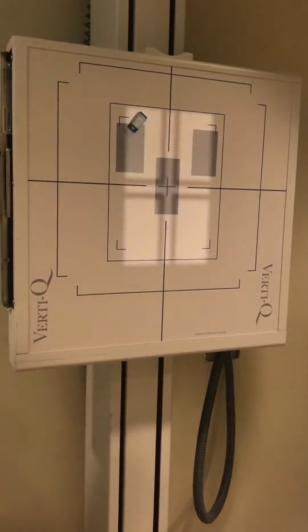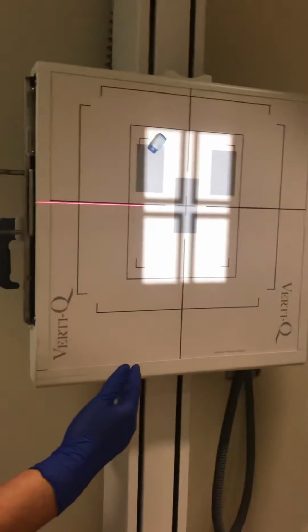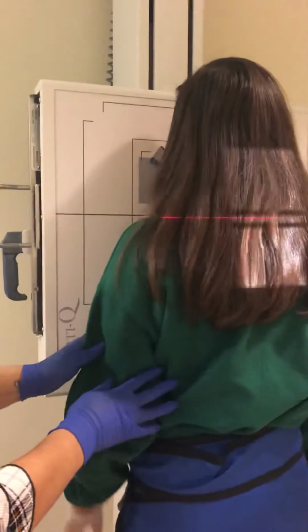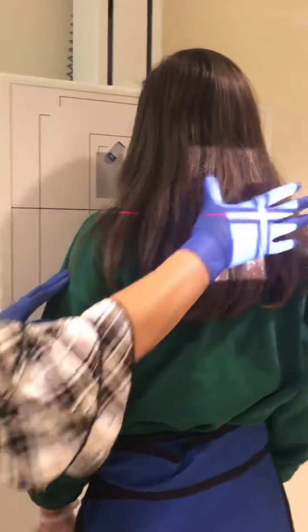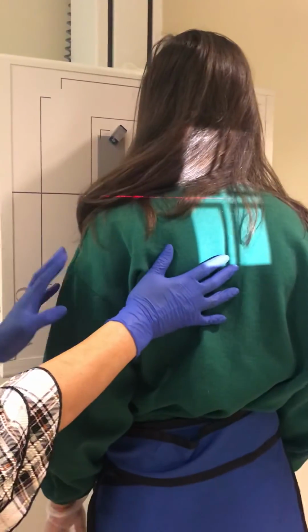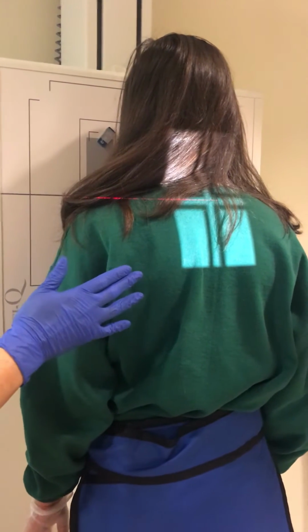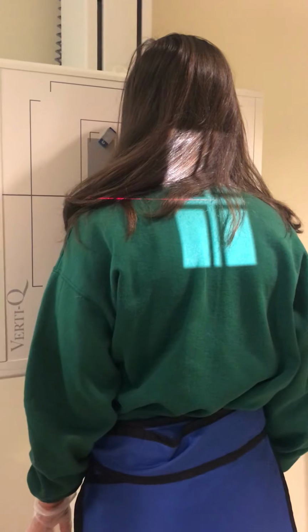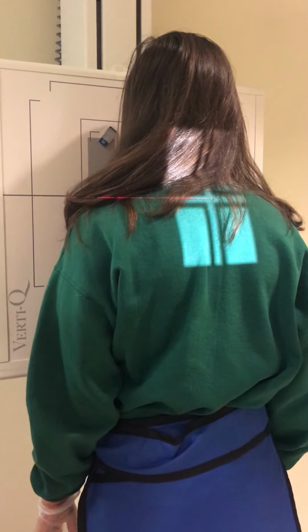Okay, this is going to be the RAO sternum, so the patient is going to put their chest up against the board. Now for the sternum, it's going to be a 15 to 20 degree obliquity. We are going to go 20 degrees if the patient is normal shaped, but if the patient is barrel chested, then we are going to go 15. So I just remember the wider people need less degree of obliquity, the average person needs more degree of obliquity.